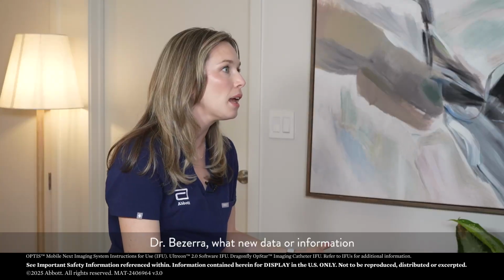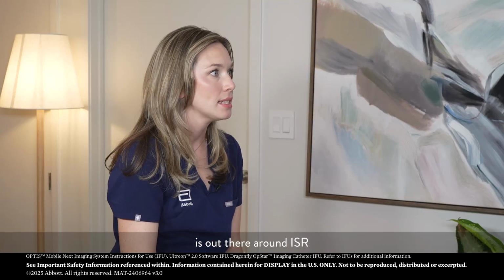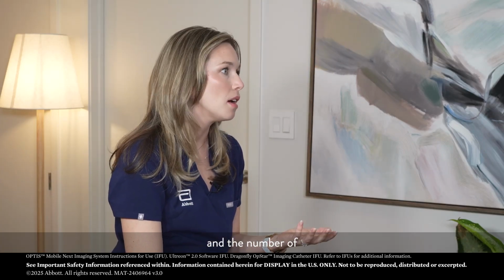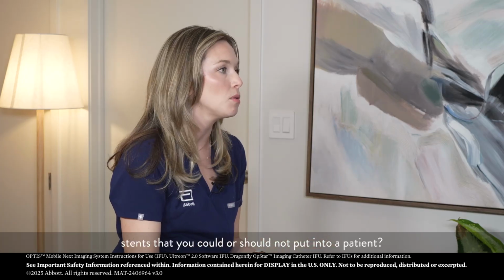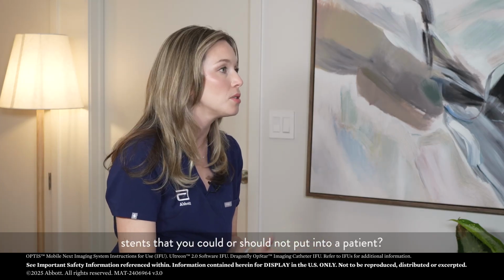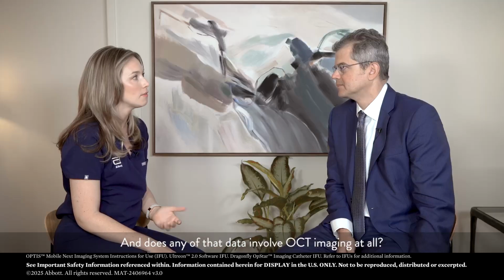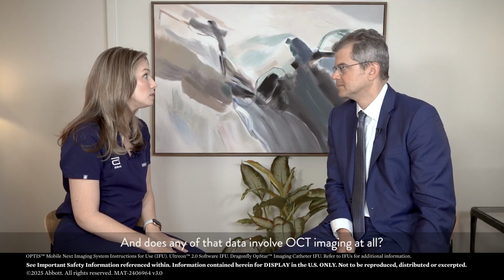Dr. Bezerra, what new data or information is out there around ISR and the number of stents that you could or should not put into a patient? And does any of that data involve OCT imaging at all?